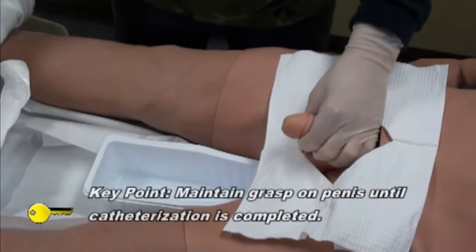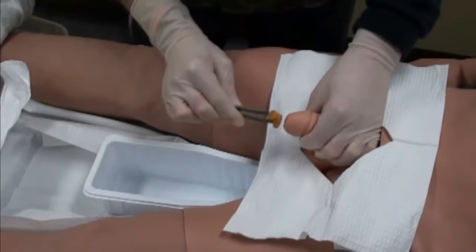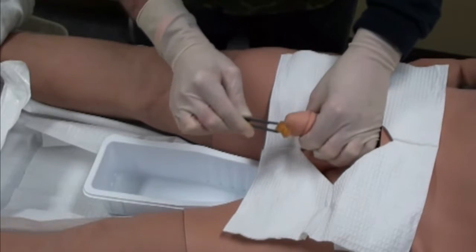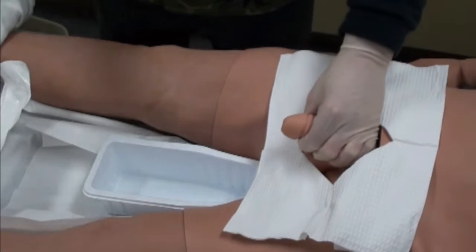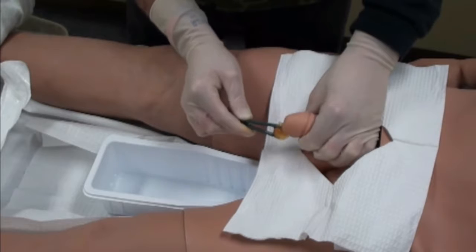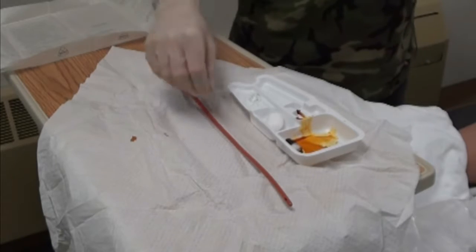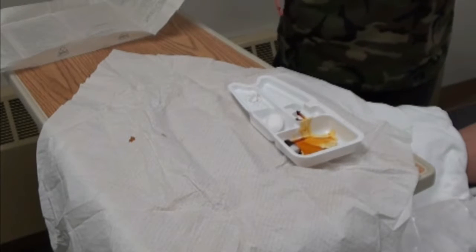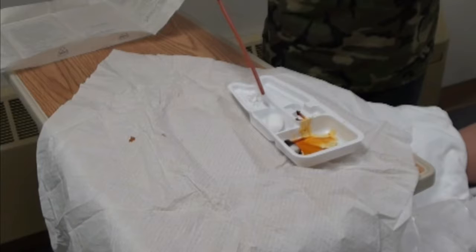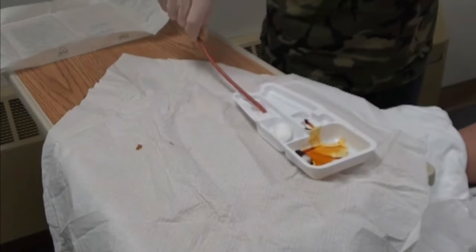First cotton ball. I'm going to repeat the process again with the second cotton ball, and finally with the third cotton ball. I'm now going to take my catheter and lubricate the end, careful to hold it up, not contaminating it. Just twirl it in the lubricant.